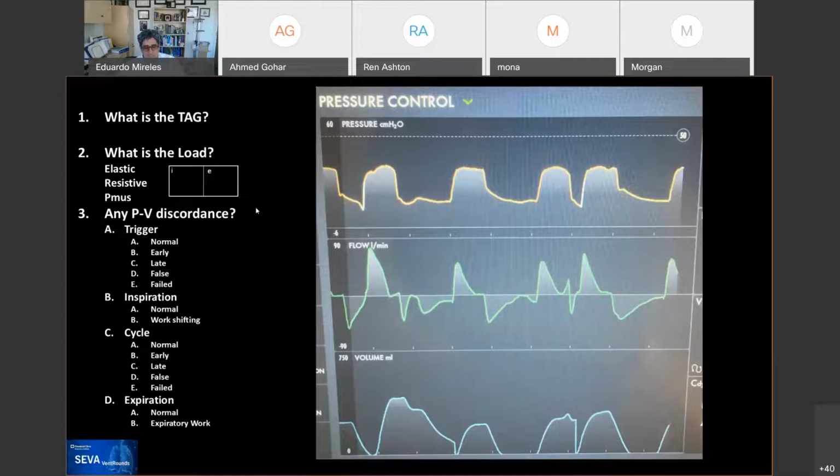And this happens often. I imagine these patients are connected to the ventilator and they build a relationship with the ventilator. It's like when your daughter brings the boyfriend for the first time to your house, and you see them for a little bit of time, but not throughout the relationship. So you just see what you see at that moment, right? And you have to judge and create a best plan for these patients throughout. Alrighty, 15 people are still doing this, so keep at it.